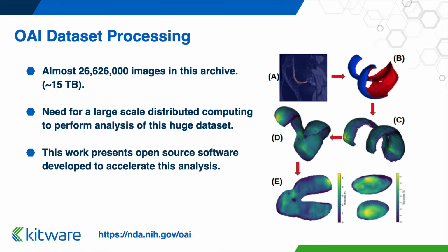To perform analysis of this entire dataset, there is a need for a large-scale distributed computing software, and this work presents an open source software developed to accelerate this analysis.